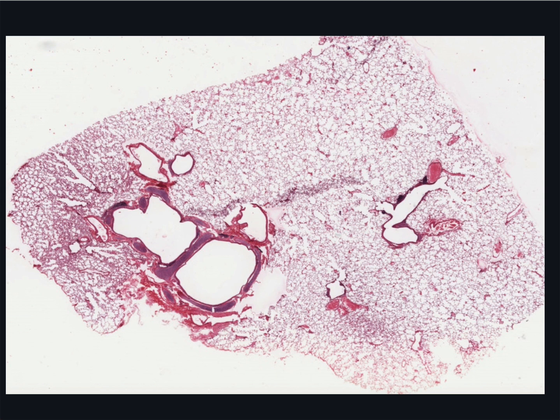At this low magnification, I can point out to you sections through two adjacent, fairly large bronchi, because I can see cartilage in their wall. A much smaller bronchus is over here, with just a hint of cartilage. And then this smaller bronchus extends into a terminal bronchiole, a respiratory bronchiole, then an alveolar duct, and finally alveolar sacs. It is this region I will return to at a higher magnification to describe the histology of this region in more detail later.